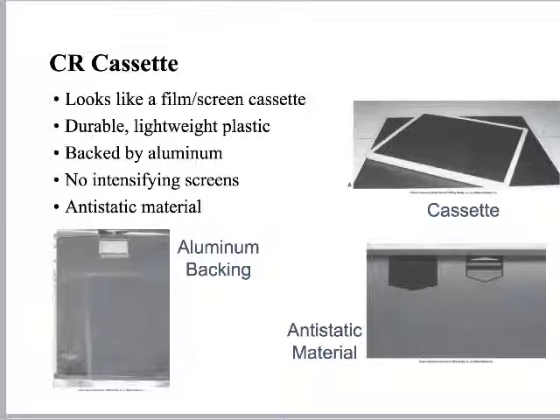It has an anti-static material, some kind of space-age stuff, that as it's slipping that photostimulable phosphor plate out of the cassette, it's not producing static. Doesn't matter how dry the environment is that you're X-raying in, right? As that plate slips out of the cassette, no static will be produced. And the reason that's really important is because the static could wind up producing an image. It could make a static artifact, right? And it would look like lightning bolts going across your image. The reason I know that is because we used to worry about that on really, really dry days in Utah, whether the static would affect our X-rays.